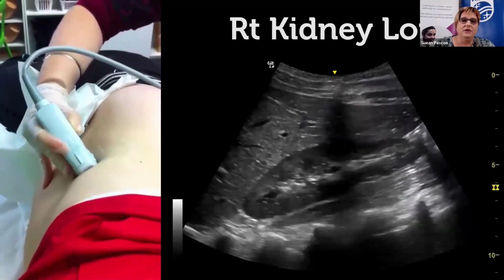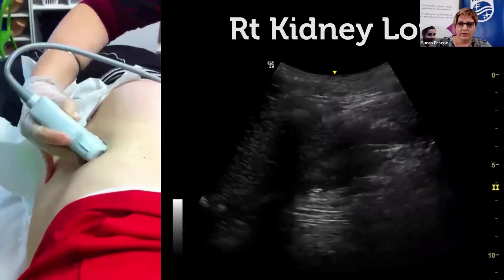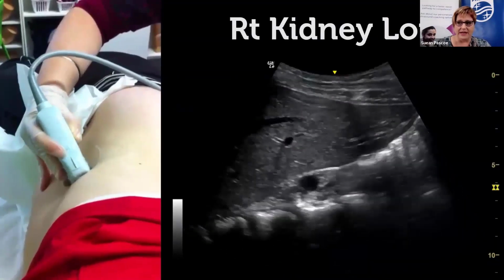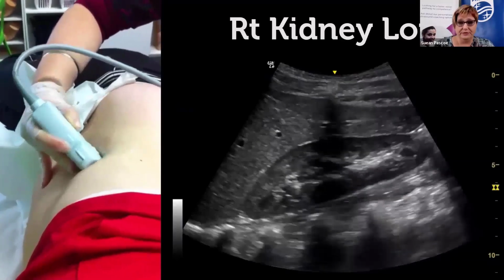And so we need to fan in the longitudinal scan plane. We align the longitudinal axis of our probe with the length of the kidney, which is often slightly oblique on the patient. And we need to scan from the medial to lateral portion.